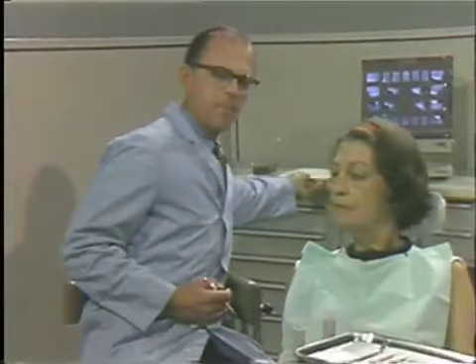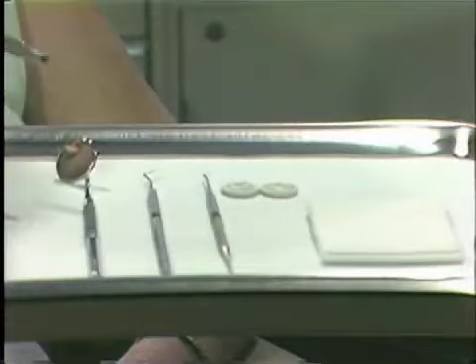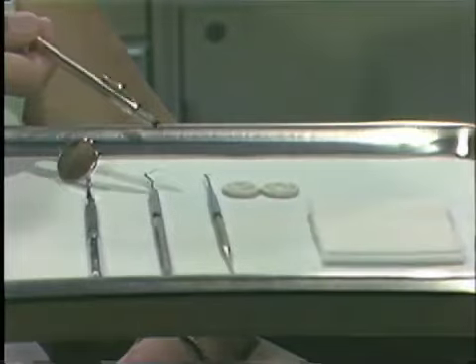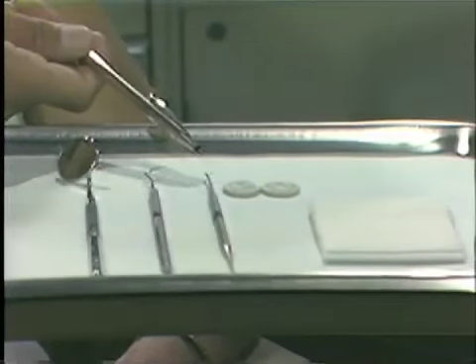The instruments that are used during the course of the examination are simple, and a minimum of material is required. We have a mirror, the probes, the periodontal probe, the cow horn probe.